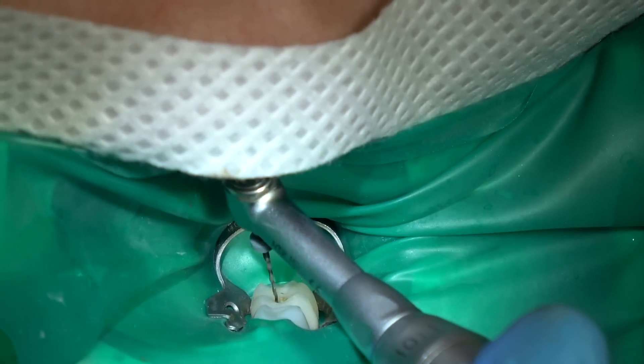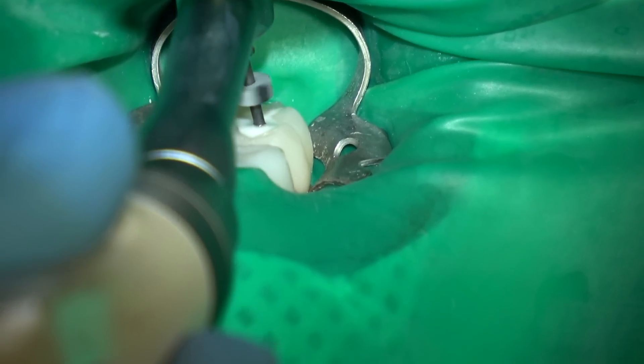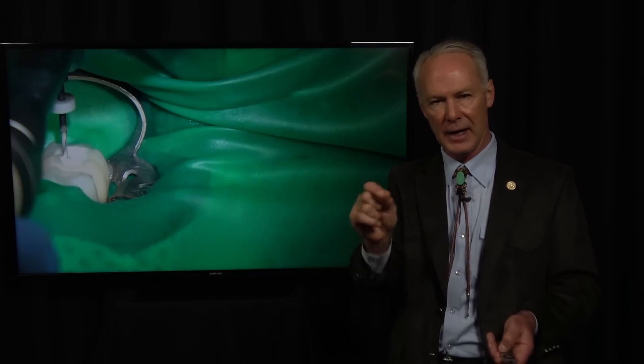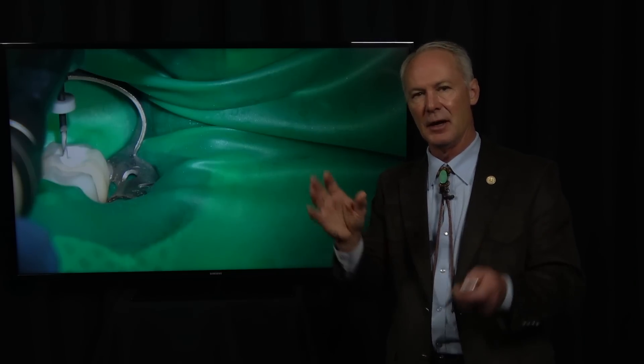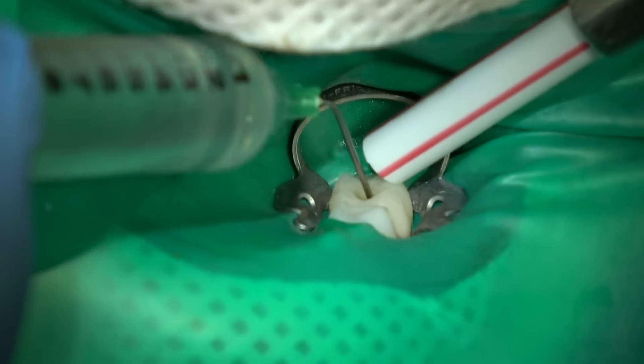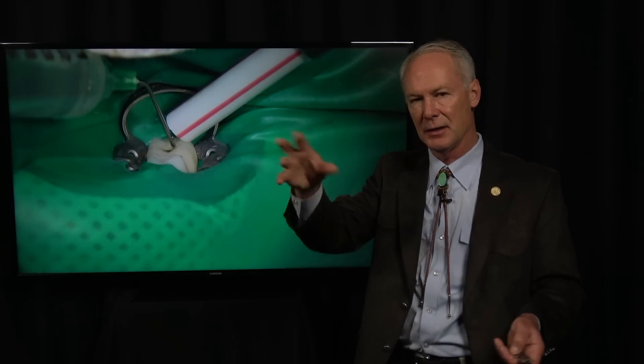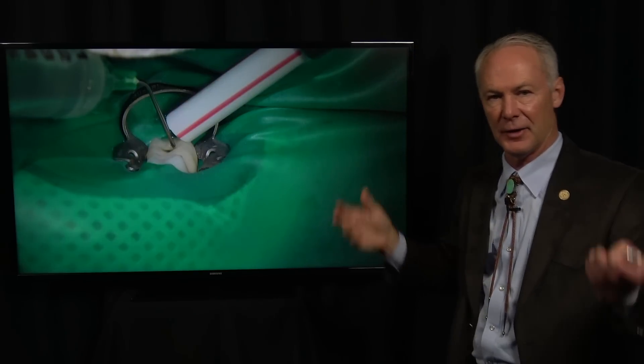Here come the drills after I've hand filed. That was the 40; now this is the 25 — see, it goes to depth. Make about three passes with each one. What if I place the 25 and it won't go to depth? Then I'm going to come back with my Hedström hand file and do some more filing to enlarge the canal just a little bit. It usually works fine coming back with the Hedström and enlarging the apical part. Don't put much pressure, and use lots and lots of irrigation.